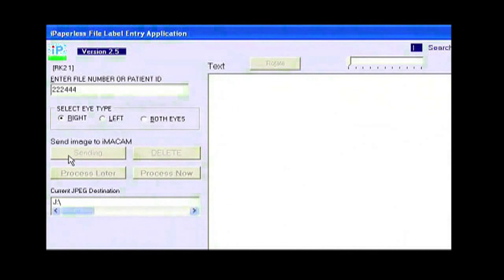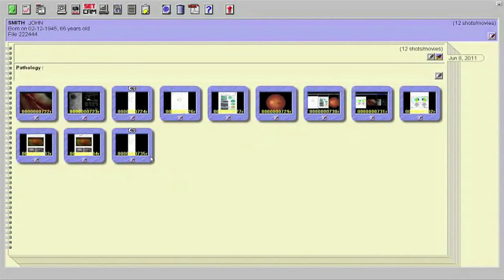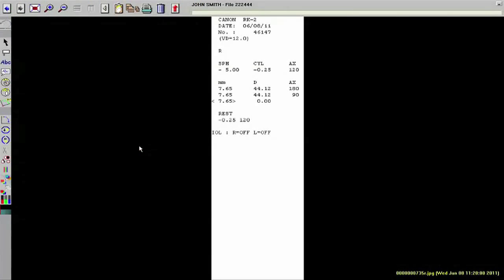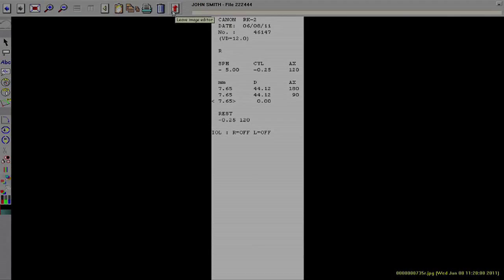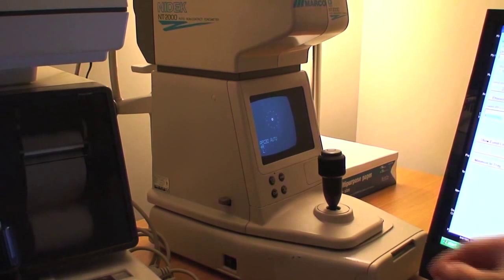Again, the data is swept automatically into the iMacam database. Some companies have written middleware software interfaces for their instruments, like Marco and TopCon.